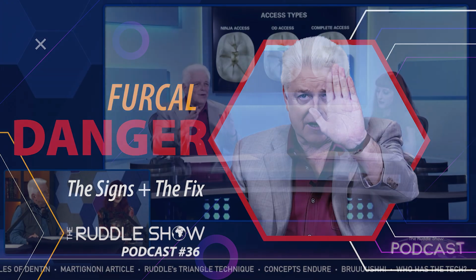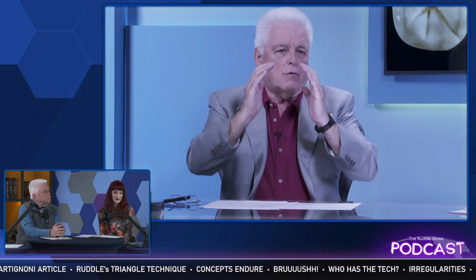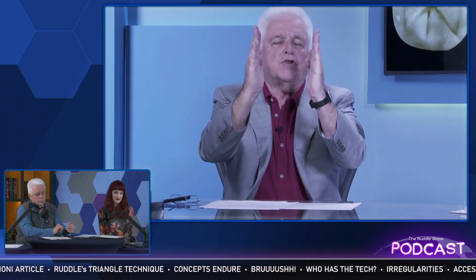Great, because when we look at furcated teeth, the canals come into the pulp chamber at pretty awkward angles. They don't just come up into the pulp chamber. They come and bend in coronally into the pulp chamber. So when colleagues start to come in to a canal without removing the triangle of dentin, you'll see they handle the file frequently off axis.